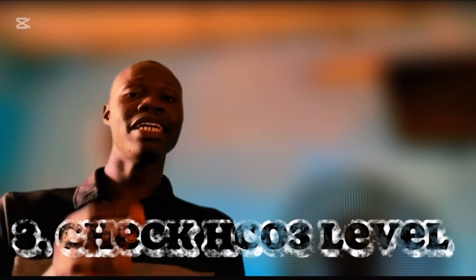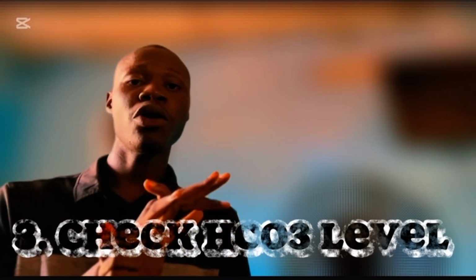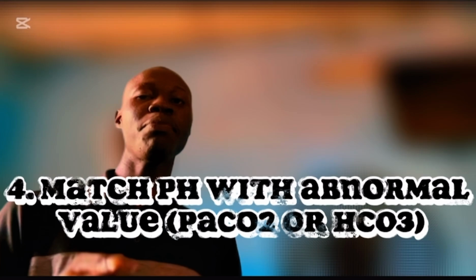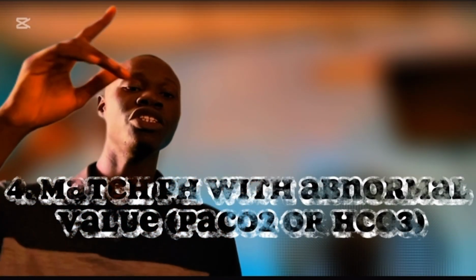So we are going to look at that. That is the third step. After analyzing the partial pressure of carbon dioxide and the bicarbonate levels, the next thing you want to do is to match the pH with the abnormal value. So if the pH is abnormal and the partial pressure of carbon dioxide is also abnormal, it means that it is a respiratory issue.